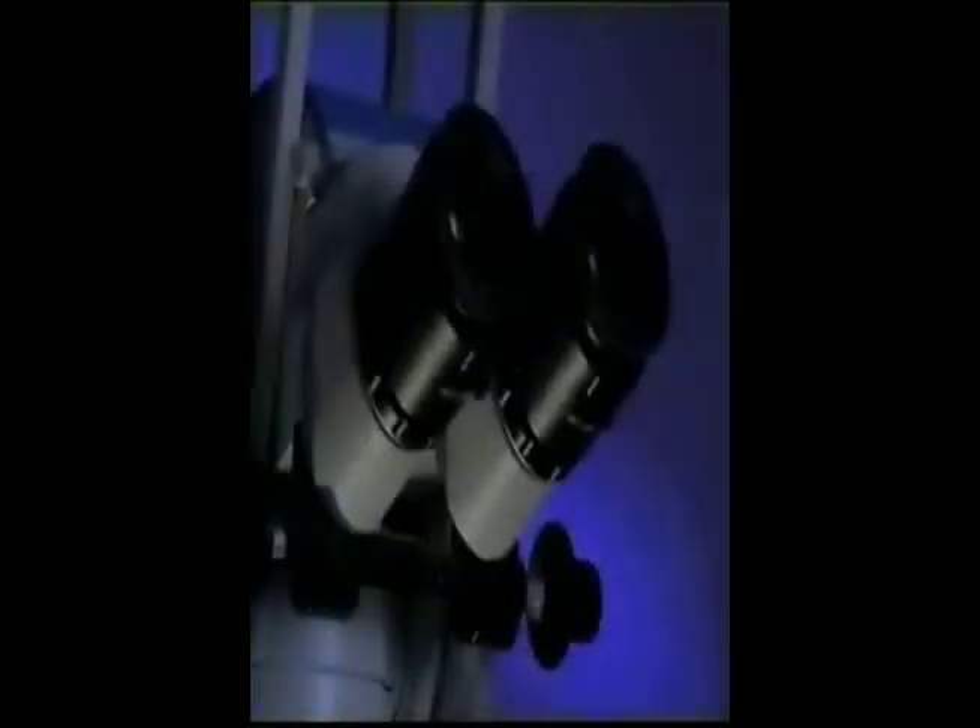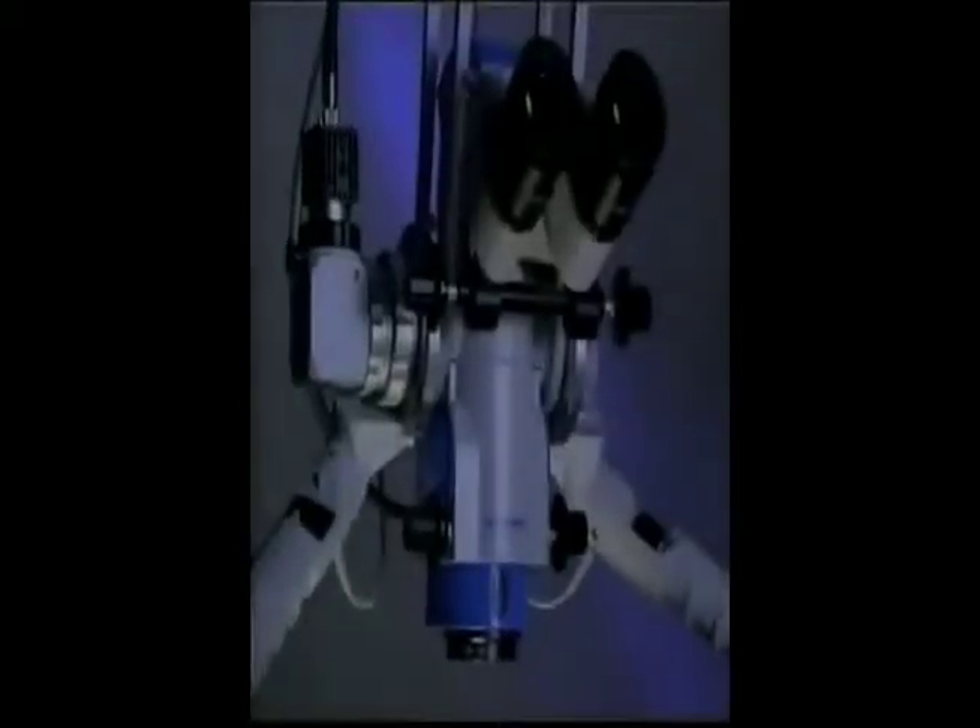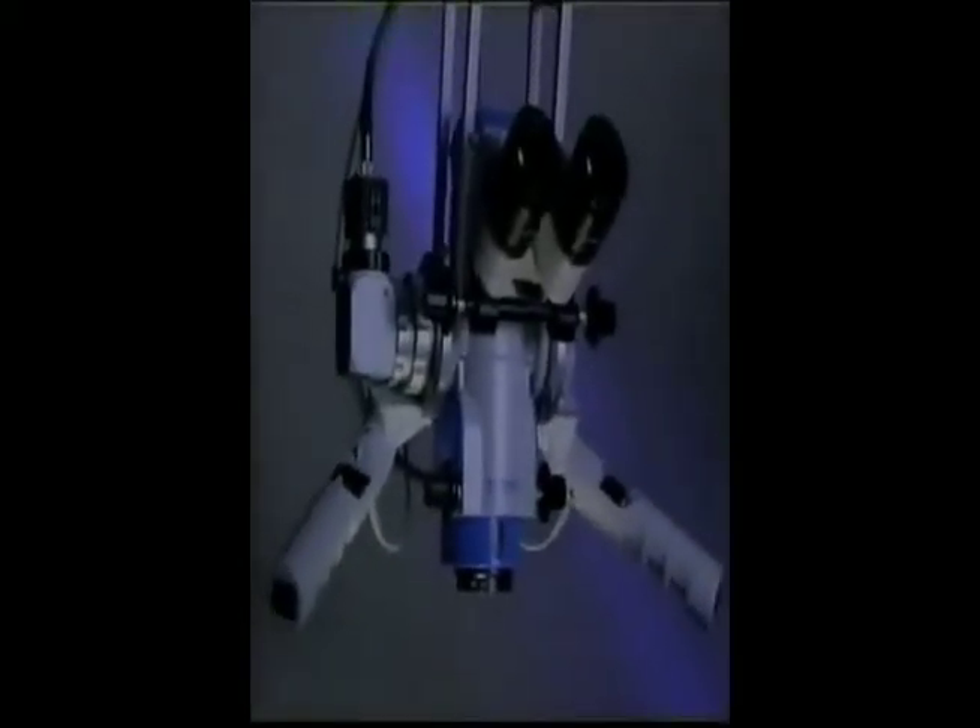This, coupled with state-of-the-art optics, provides a new level of stereoscopic perception and depth of field. You will clearly see details that would be impossible to see with loupes or even other microscopes. Another very useful feature is the microscope's built-in beam splitter, which allows an observer or video camera to capture and record every detail of the surgery.